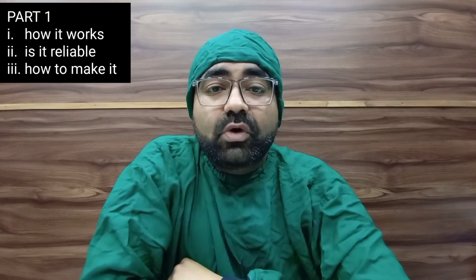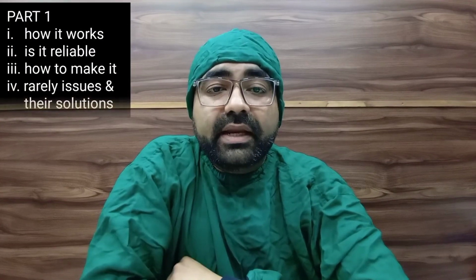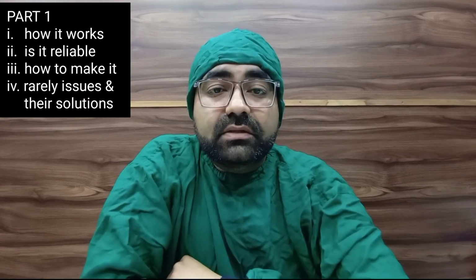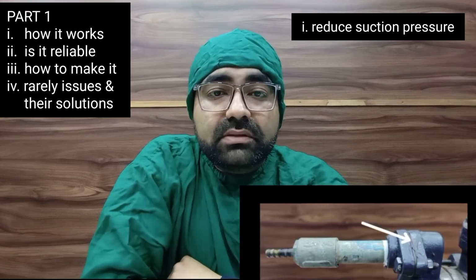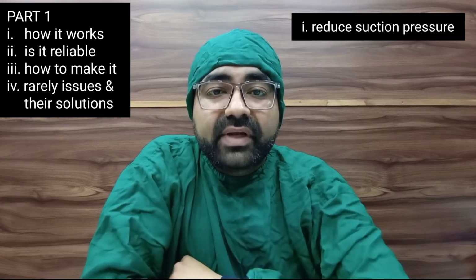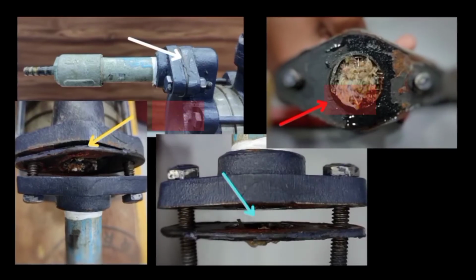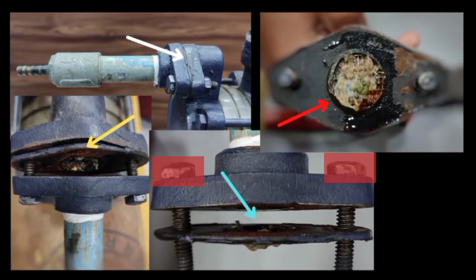Now, as always, I am more interested in complications, so I will also mention a few very rarely occurring issues with motorized suction and how you can solve them easily. First, reduced suction pressure. All good quality motor pumps have a small filter at its inlet end. This filter is used to prevent any debris from entering the motor pump. So, the pressure of your suction reduces. Just open these 2 screws and clean out the filter. This will solve your problem.